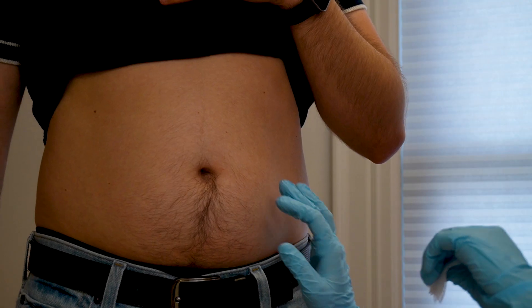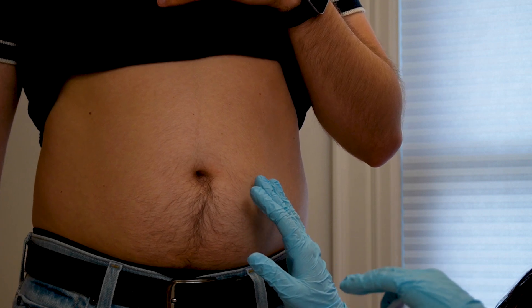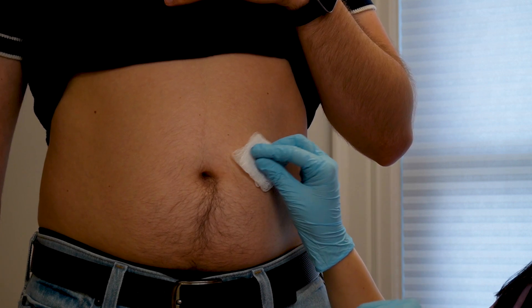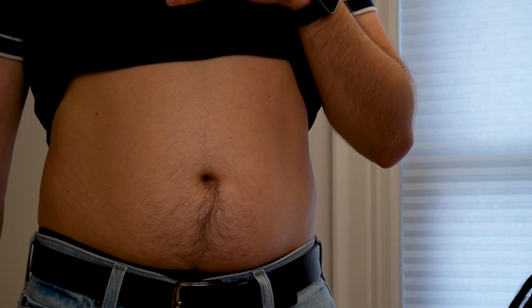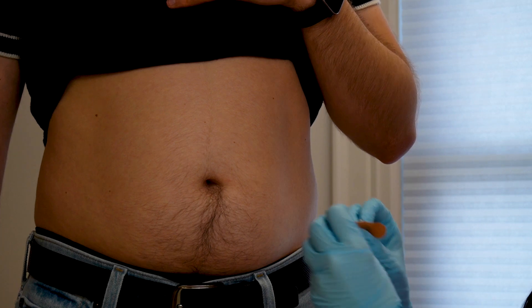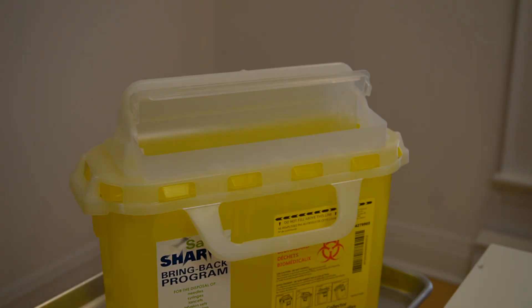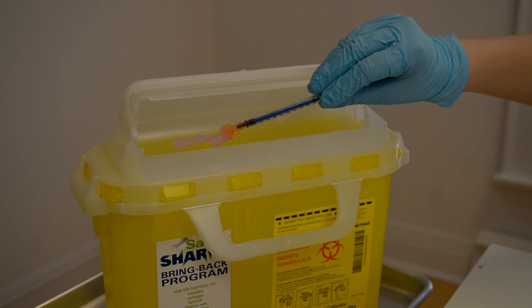If you have any medication leaking out or any bleeding, that's absolutely normal because we have a lot of small vessels around that area. Just gently pad with a small piece of gauze. If the area is still a little uncomfortable, apply a small band-aid for the next half hour. Don't forget to use your sharps container and discard your needles correctly — place all needles in the sharps container and discard safely. Thank you so much for your attention. Coastal is always here for you — by phone, video, or in person. Please feel free to book an appointment with our nursing staff for injection teaching. Thank you, and call us anytime!